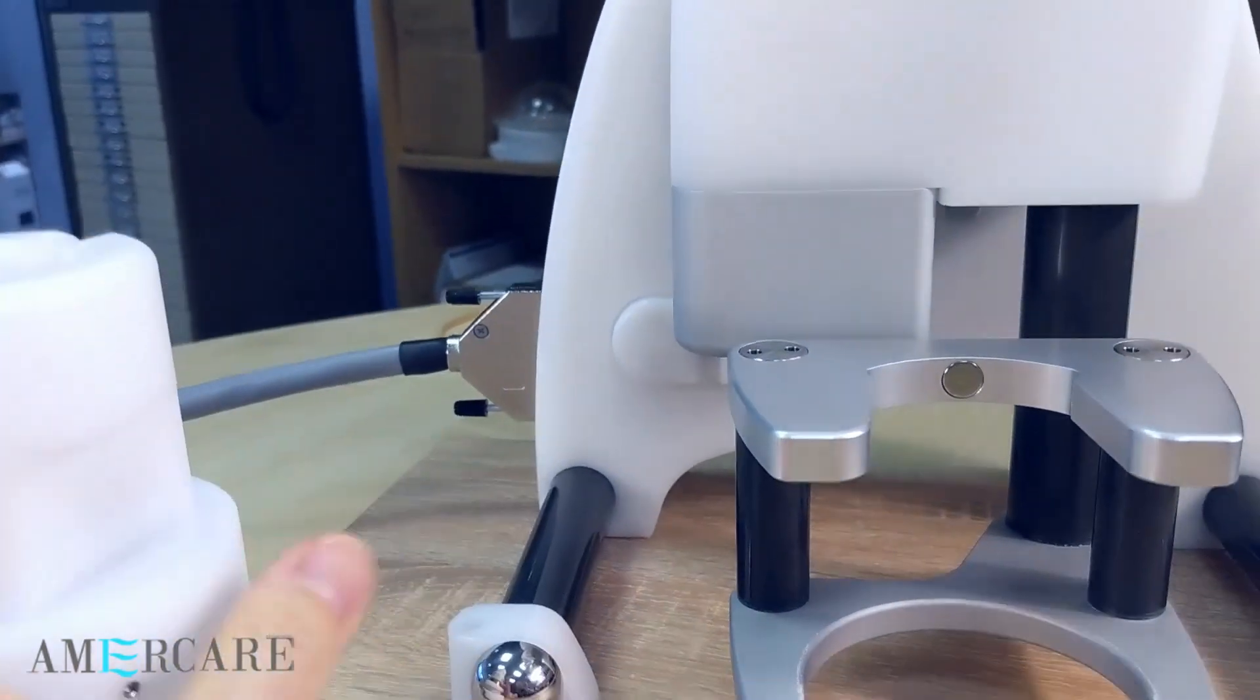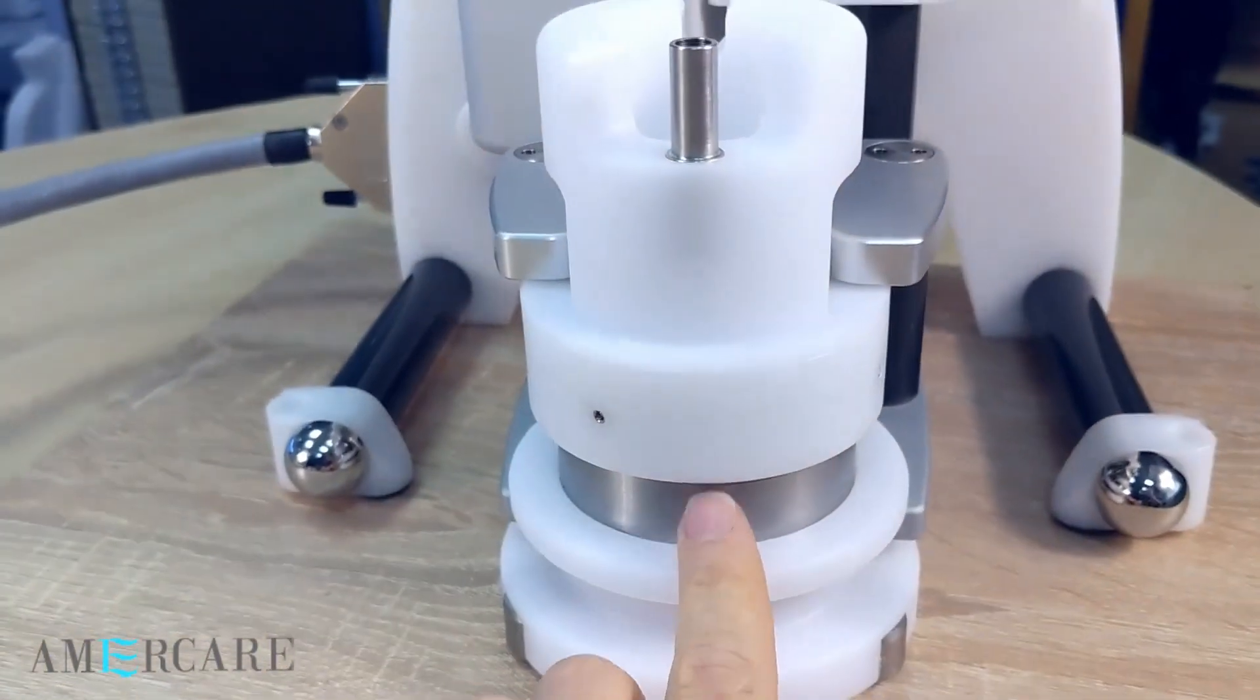When the vial shield assembly is in position, the machine knows if the shield has been correctly loaded.